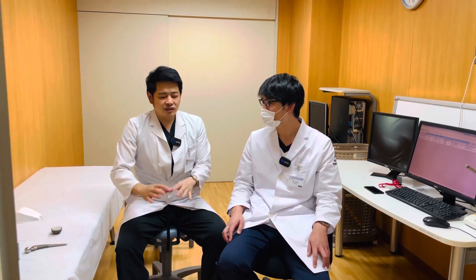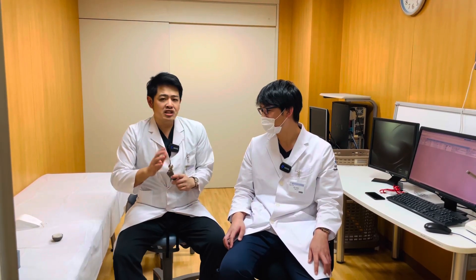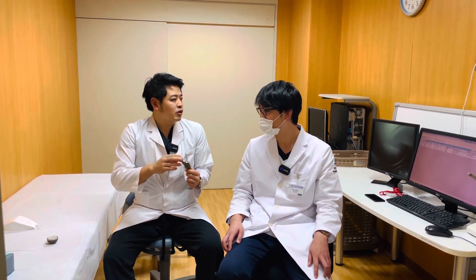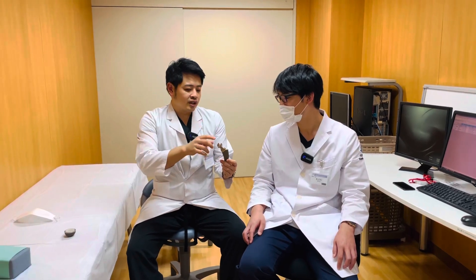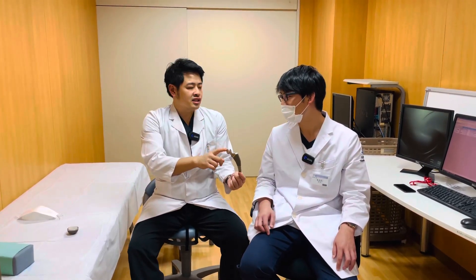Today I would like to ask about the special implant that is available only in Japan. In Japan, we have no implant like this. What is its name? Kinective stem. It is Kinective.